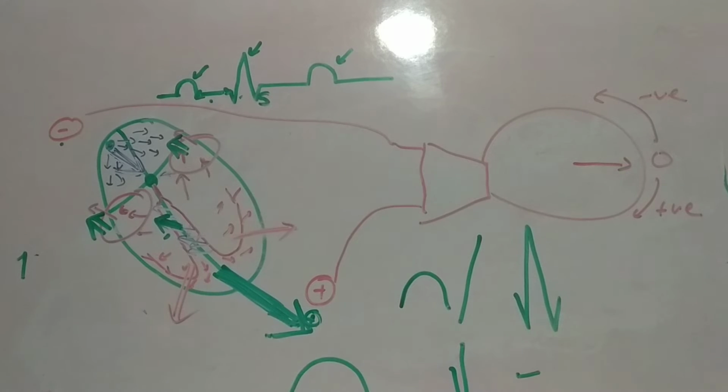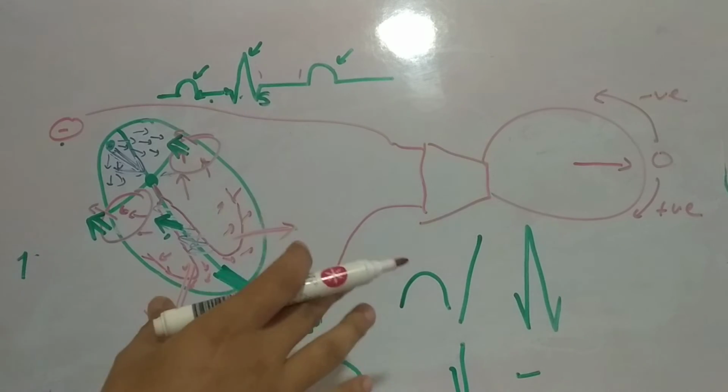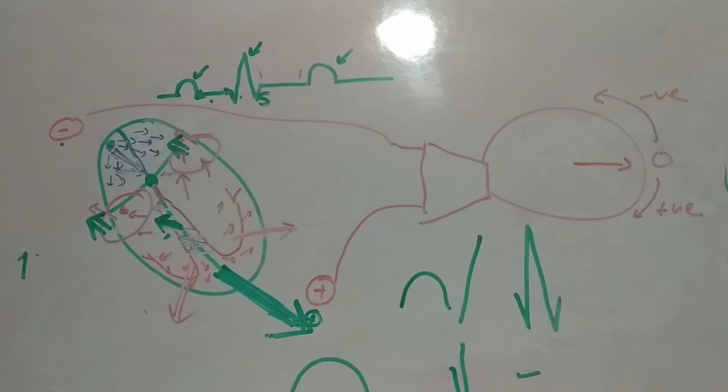Now what is this ST segment? This ST segment is nothing but the ongoing representation of ventricular depolarization and gradually the ventricular contraction. So the ST segment especially denotes the ventricular contraction. Now we have our T wave here.